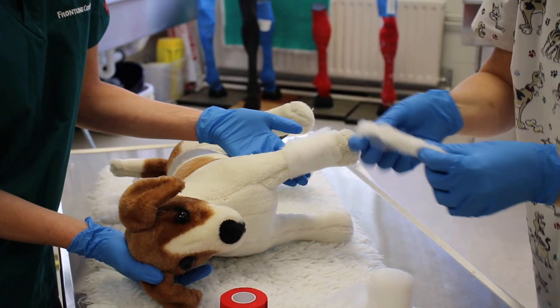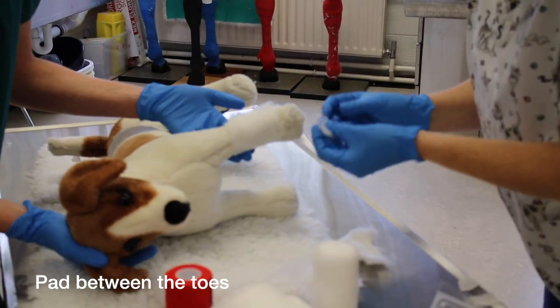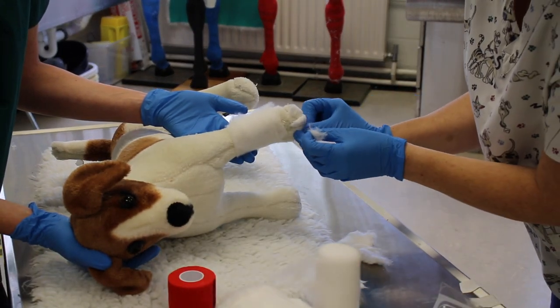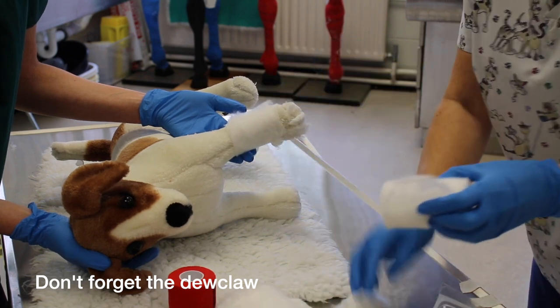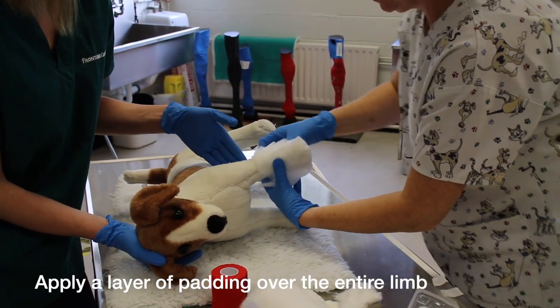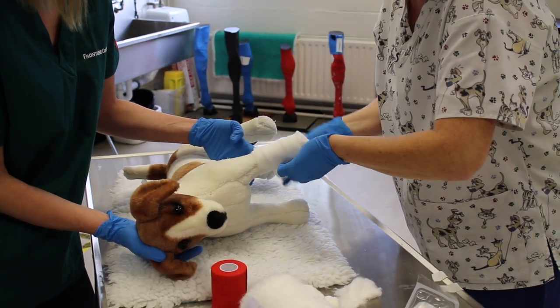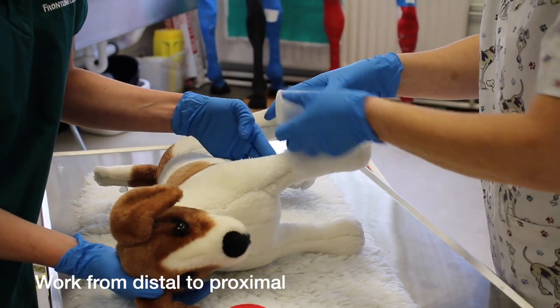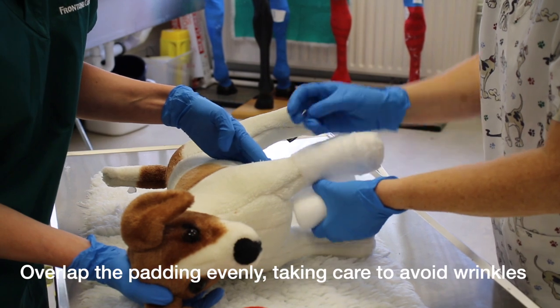We're going to pad between our toes for patient comfort. Don't forget your dewclaw. We need to apply our padding all the way up the limb, right up and over the elbow. We start at the distal end and work proximal, and each time you're covering your previous layer by 50% to keep your tension even the entire length of the bandage.